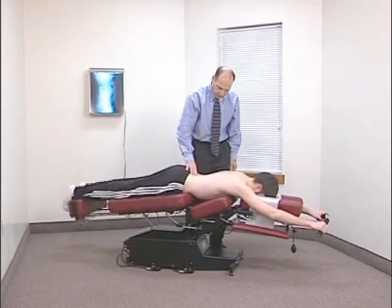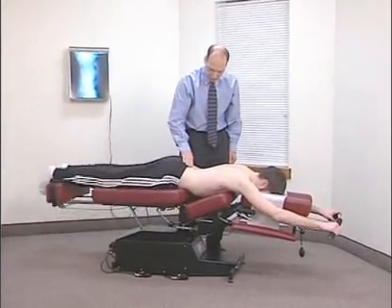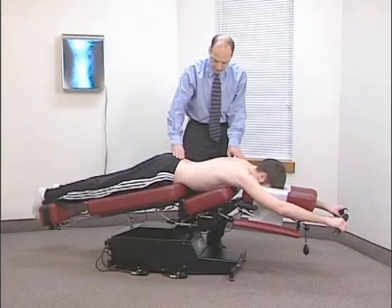Gently rock the patient's lumbar spine side to side. By rocking the lumbar spine, this warns the patient that the table will begin to move, eliminating any surprises. After the table has made one complete cycle of motion, ask the patient if they are feeling any discomfort in the low back, hips, or legs. If the patient feels no discomfort, continue with the movement of the table.